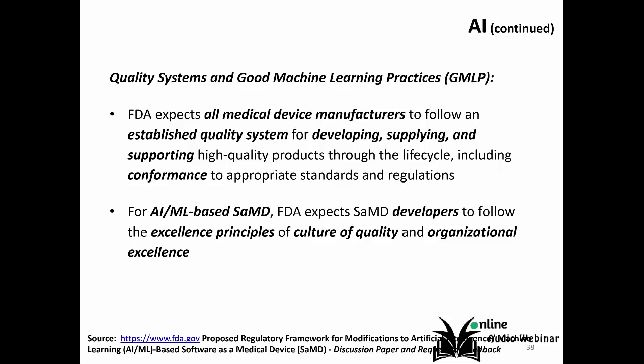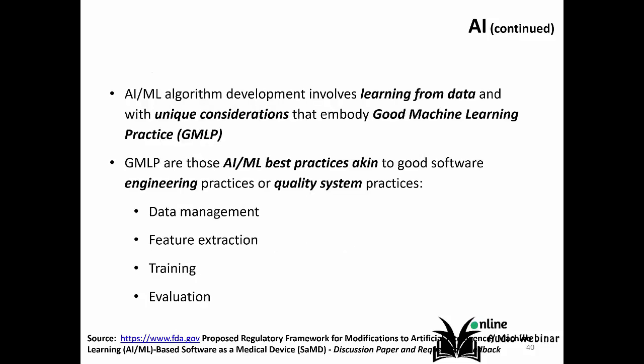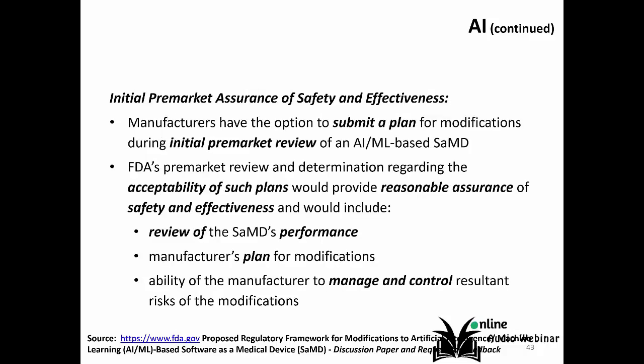Quality systems and good machine learning practices. The FDA expects every medical device manufacturer to follow an established quality system when they develop, supply, and support high-quality products through the life cycle. Devices that rely on AI/ML must demonstrate analytical and clinical validation. AI/ML algorithm development involves learning from data and has unique considerations, and that embodies good machine learning practice, GMLP. Now, the initial pre-market assurance of safety and effectiveness has to be in place.